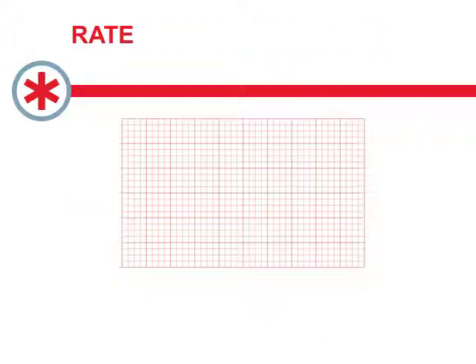So just to orient us briefly, I think you're all familiar with this. This is basically some ECG paper, and you'll recognize that ECG paper has these tiny little blocks that are roughly a millimeter in size, and they're divided up into larger blocks of 5 millimeters. So tiny little blocks of 1 millimeter, and then the bigger blocks that are 5 millimeters in size. And realistically, when it comes to figuring out the heart rate on an ECG, most of us use two things.